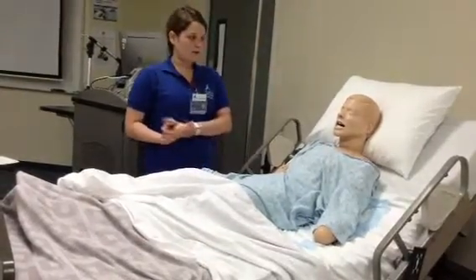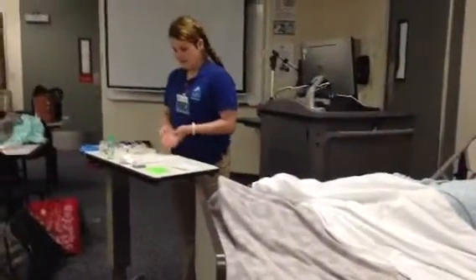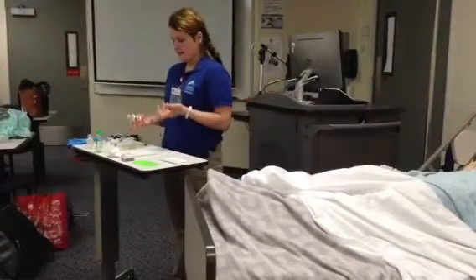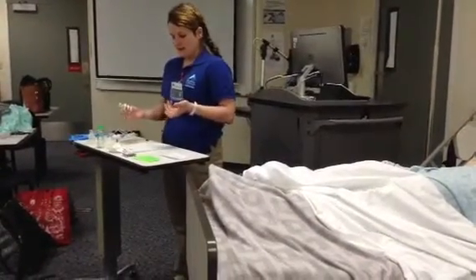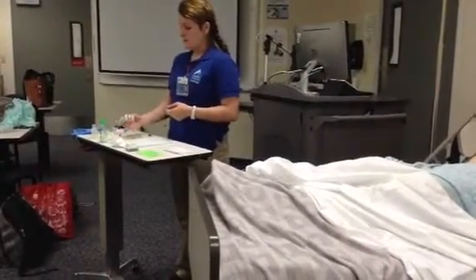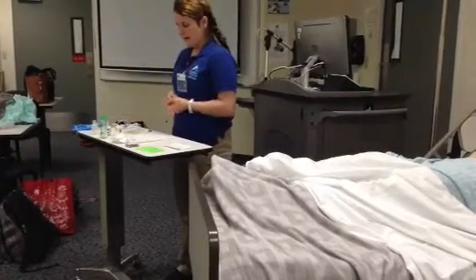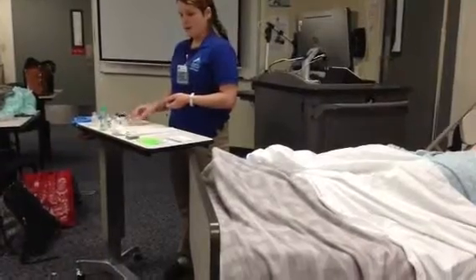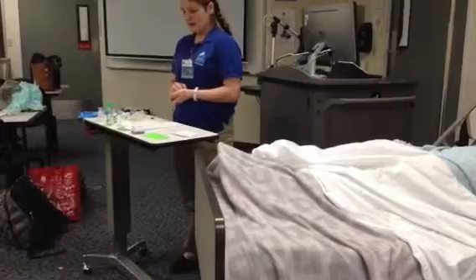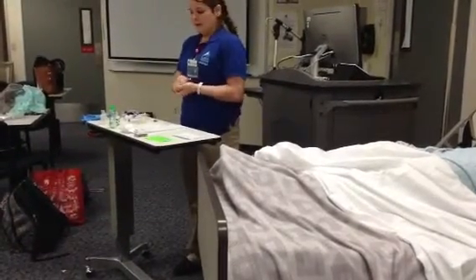So I'm going to go get your medication ready for you, okay? All right, so I'm going to check my MAR. The doctor ordered 500 milligrams of vancomycin Q6 hours in his peripheral IV. So the bottle contains 500 milligrams per 1 milliliter. So I'm going to give him 1 milliliter of vancomycin in a 100 milliliter IV bag. And it's going to run over 60 minutes. It's going to be 17 drops a minute.